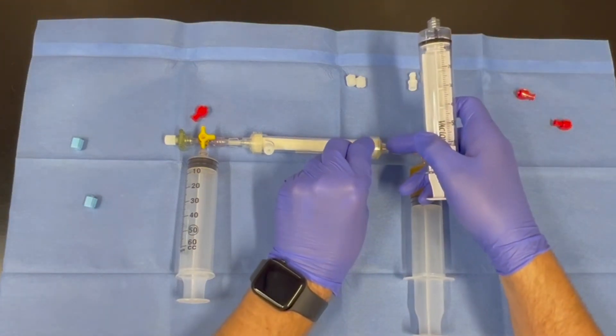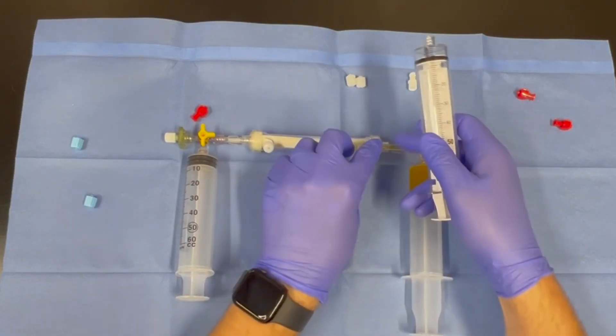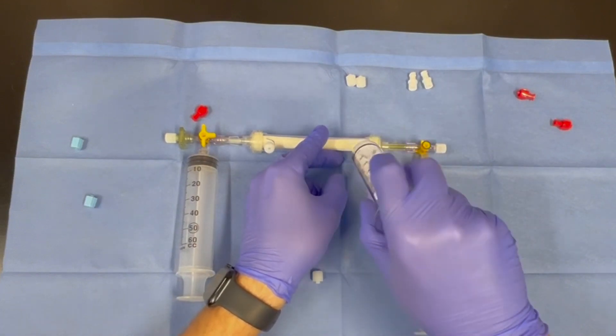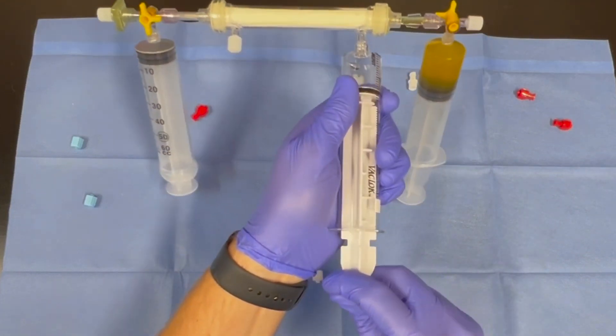Next, remove one of the white caps on the bottom of the filter and attach the primed vac lock syringe. Once the vac lock syringe has been attached, pull the plunger back and engage the vac lock syringe.